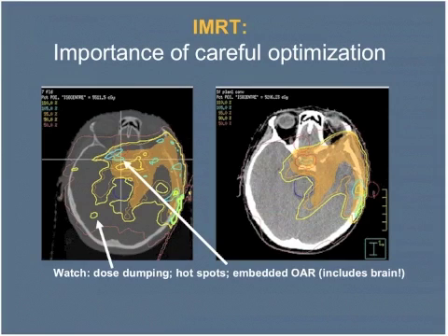But IMRT is tricky to do, and it relies on computerized planning to determine these beam fluences. And if you do not tell the computer what you want carefully, or you don't monitor the computer carefully, you can end up with sloppy IMRT distributions.